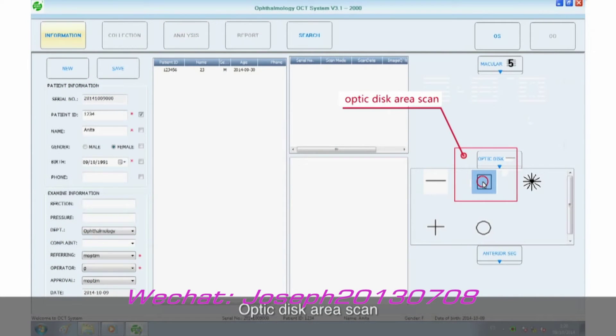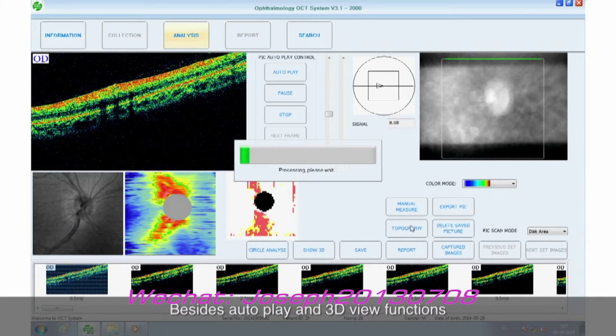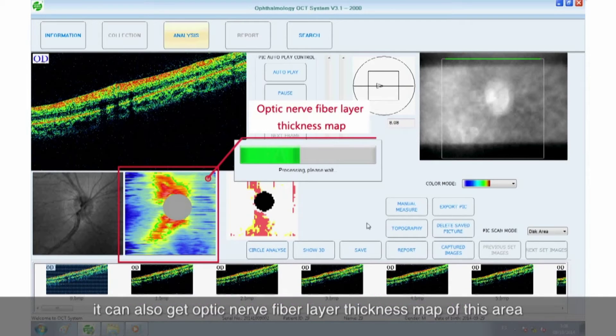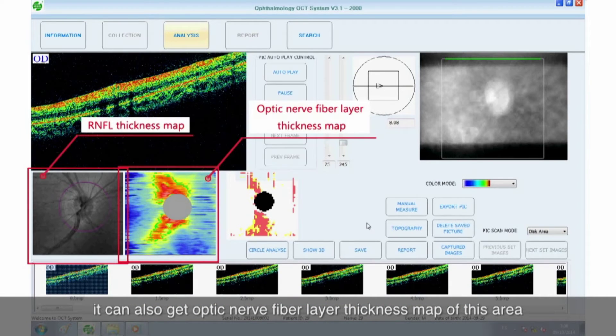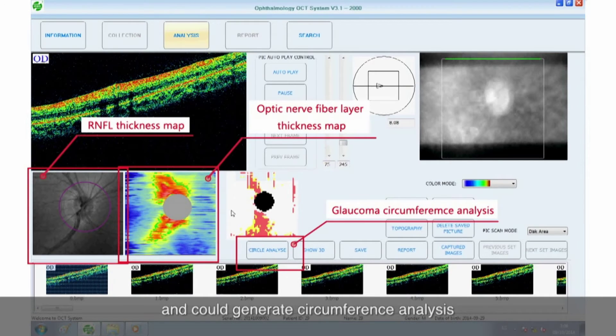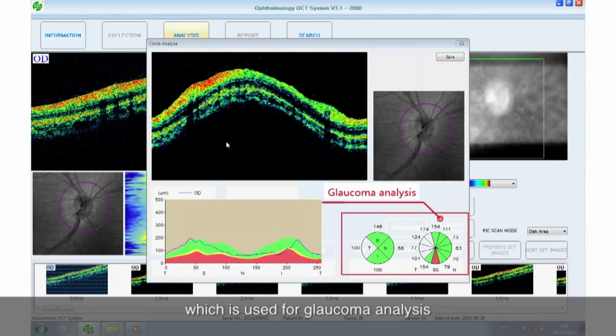Optic disc area scan. Besides autoplay and 3D view functions, it can also get optic nerve fiber layer thickness map of this area and could generate circumference analysis which is used for glaucoma analysis.